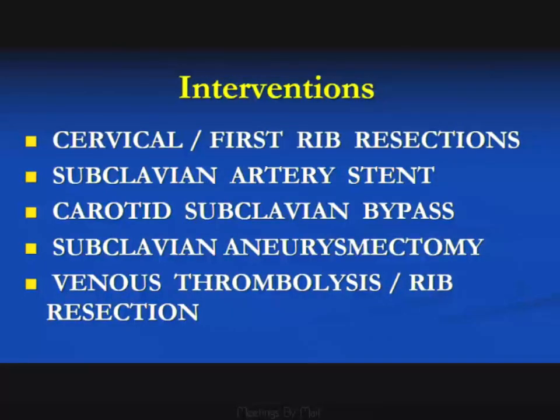In patients with venous thrombosis, the management of those patients often is, as you know, anticoagulation supplemented with angioplasty of the vein, and in some patients venous stents, with or without a rib resection. So those patients who've had interventions throughout all these types of procedures, their post-procedure status can be well established by doing an angiographic CT, or in the case of the venous studies, we would do an ipsilateral antecubital vein injection with dilute contrast material and do a staged CT venogram.